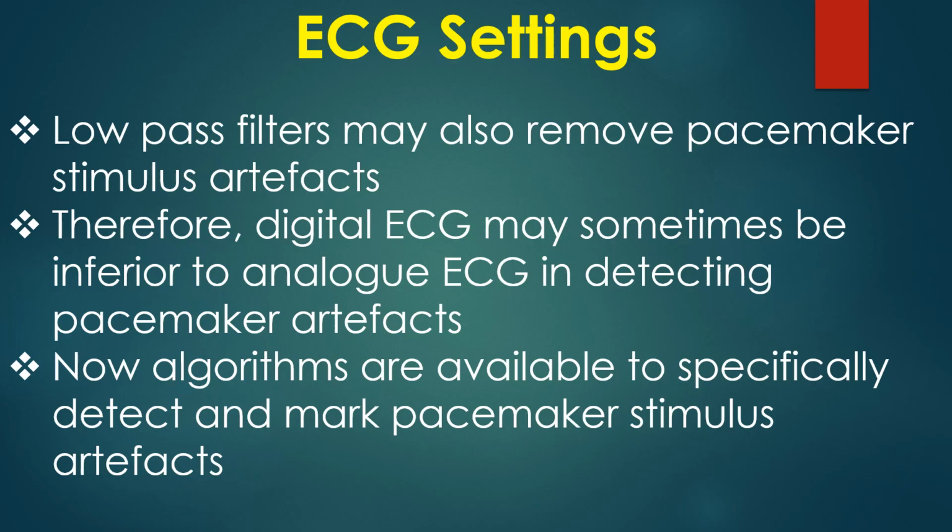Low pass filters may also remove pacemaker stimulus artifacts. Therefore, digital ECG may sometimes be inferior to analog ECG in detecting pacemaker artifacts. Now, algorithms are available to specifically detect and mark pacemaker stimulus artifacts.